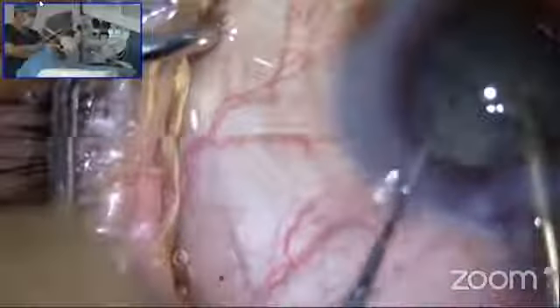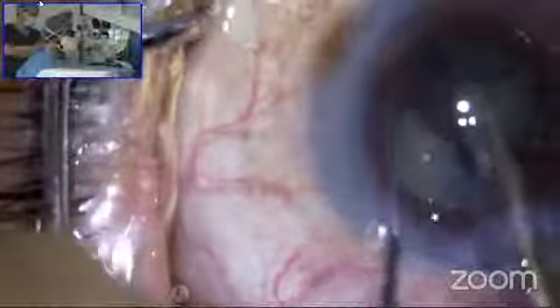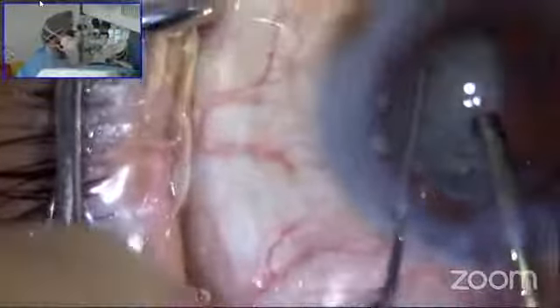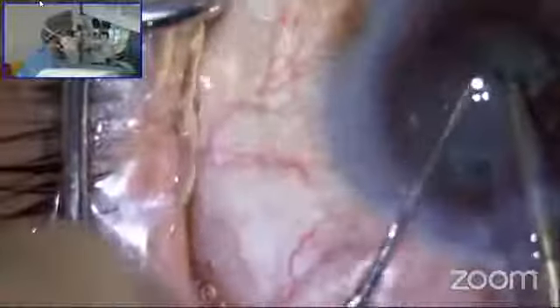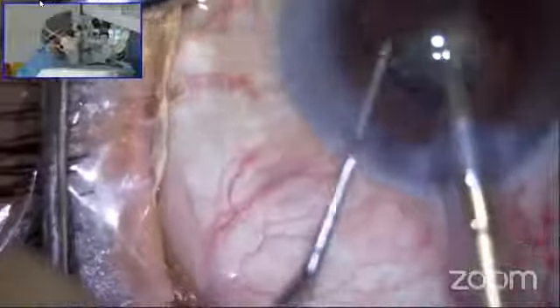Now go to quadrant mode — we are increasing the vacuum. Settings on quadrant mode: about 425 vacuum, 45 power, aspiration 38. You can see how easily the nucleus gets removed — it was a grade 3 cataract. You can see the separation. Even though the pupil is small, I am restricting myself to the central part of the pupil. The surge control is very good with the Signature probe.